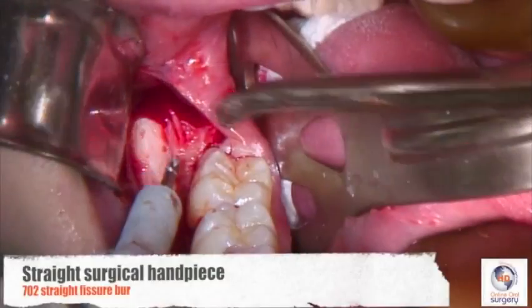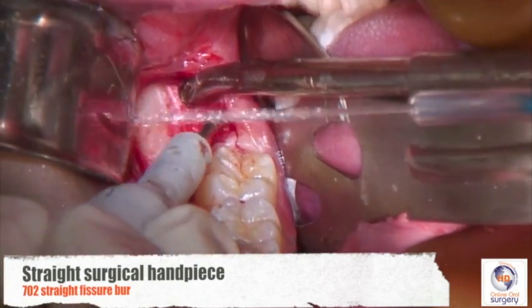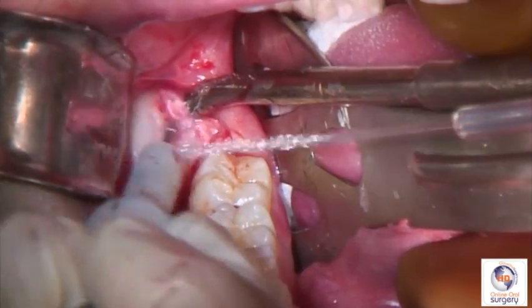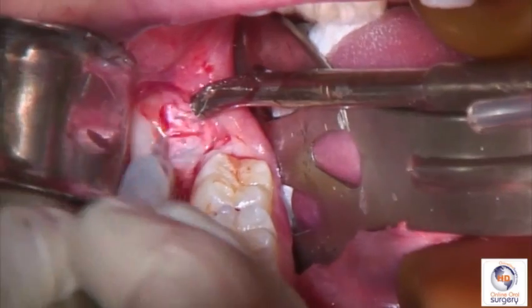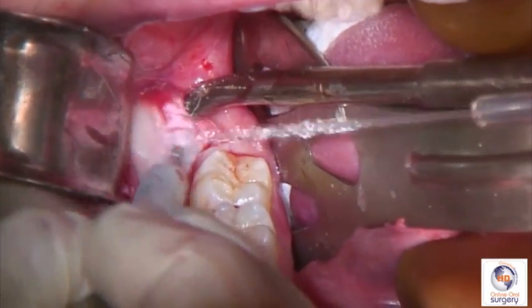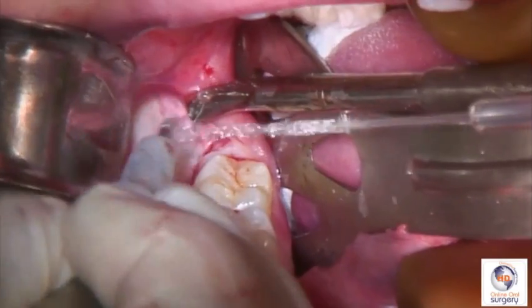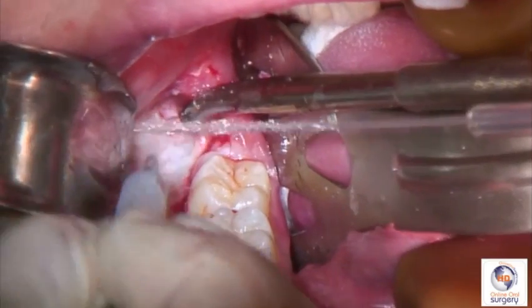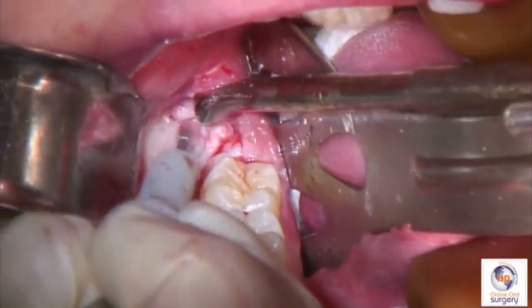So we now begin our procedure using a straight surgical handpiece. In this case, I'm using a 702 straight fissure burr with lots and lots of irrigation, and kind of using the burr as a paintbrush, just painting away lightly with very light pressure, just painting away the bone that's covering tooth number 32. So I'm going to go over the full extent of where the tooth is hiding.